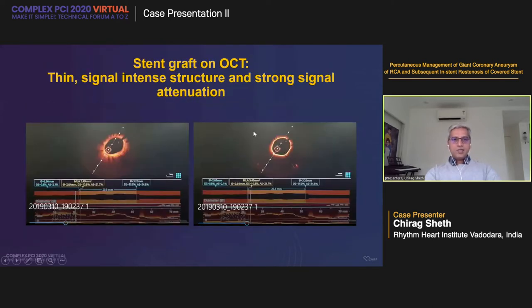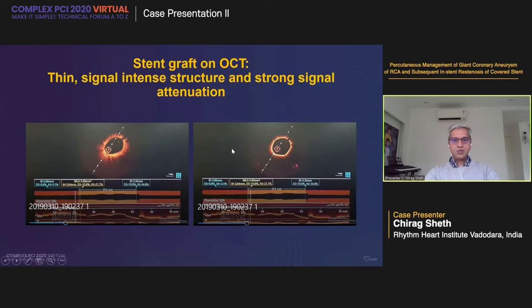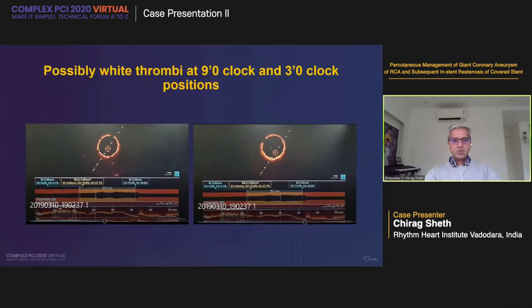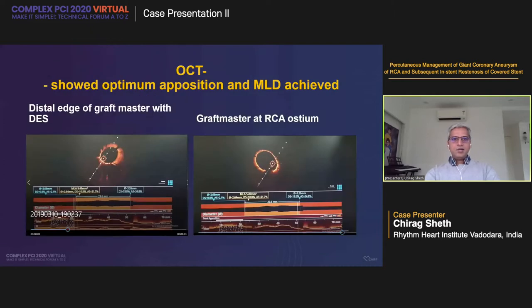The stent graft on OCT appeared as a thin signal-intense structure with strong signal attenuation, compared to the previously placed drug-eluting stent visible on the other side of the image. At some focal points there appeared to be thrombi at the 9 o'clock and 3 o'clock positions. Overall, OCT showed optimum apposition and MLD was achieved throughout the length of the deployed GraftMaster.